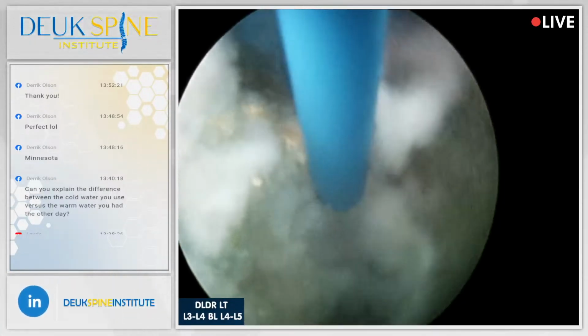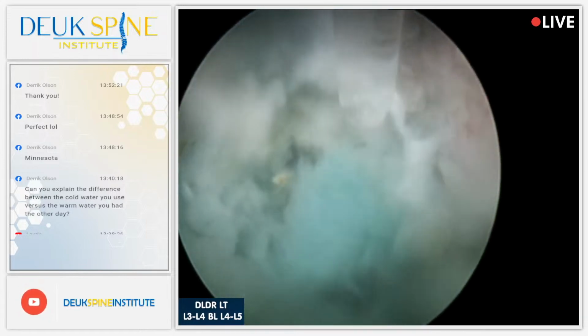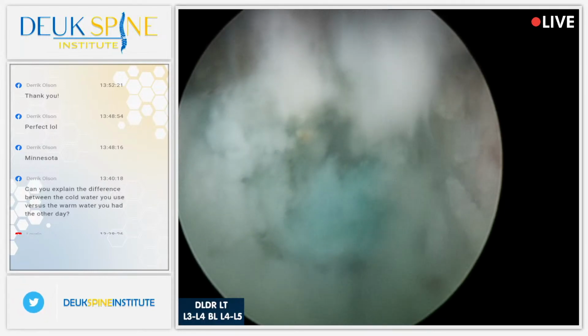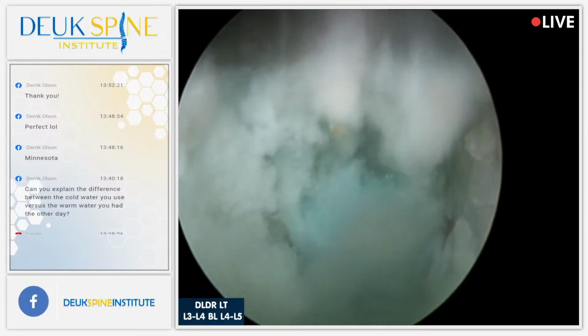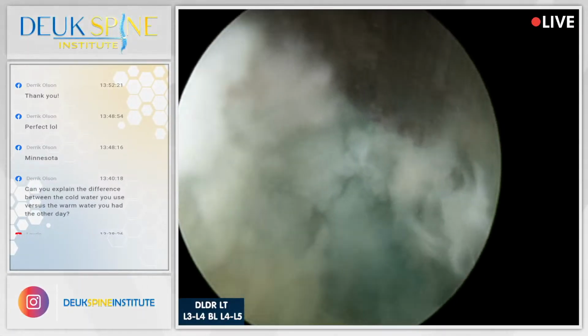It just can't without the Duke laser disc repair. This surgery clears out, see the blue thing right here? That blue thing is a herniation of the nucleus. That's the nucleus pulposus. That's stuck in the annular tear, blocking the annular tear from healing. Literally blocking it.